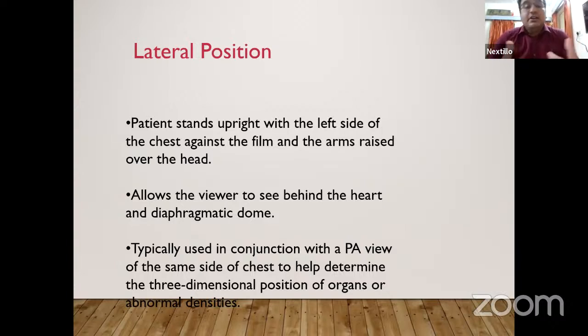The other area is the retrosternal area. Between the heart and sternum, there is some part that is called the retrosternal area. So due to that reason, it could be missed. In case we are on an AP view and have any sort of suspicion, we can take help of the lateral view for actual visualization of these hidden areas.